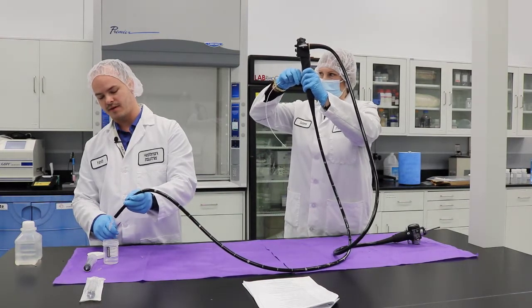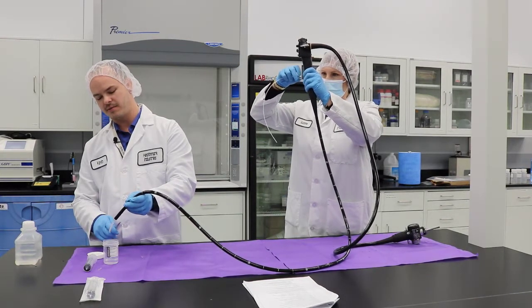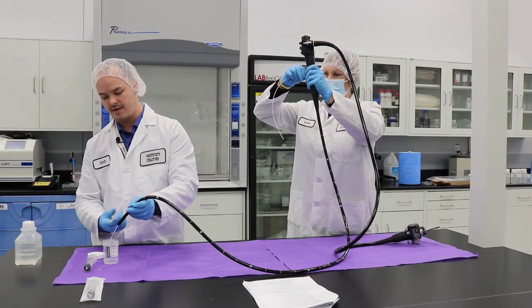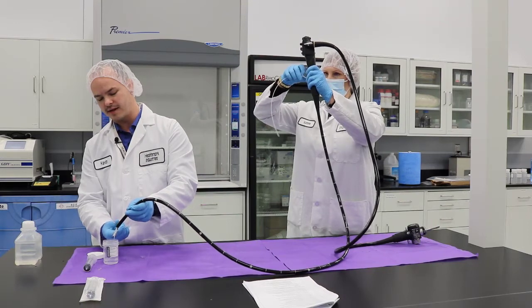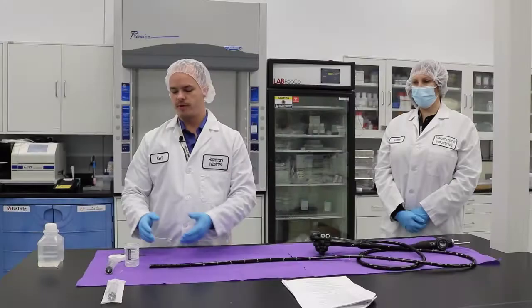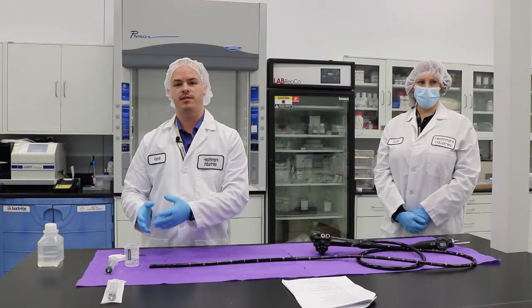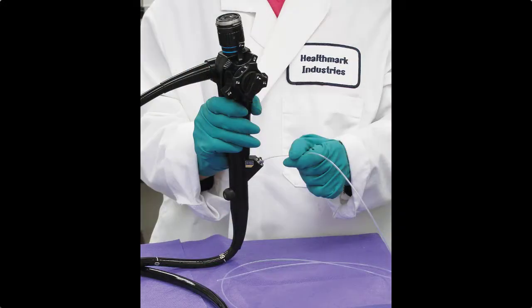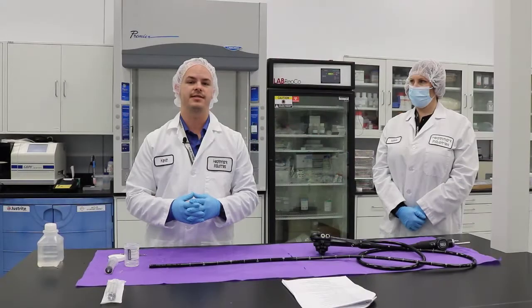You can see the brush coming out the end — advance it a little bit more. Now I'm going to use the scissor that comes in the kit and cut it so that it falls into our sample. We cut the distal tip of the brush into our container. Our facilitator will retract the rest of the brush handle back through the biopsy port where we inserted it, so as not to contaminate this side of our testing station.